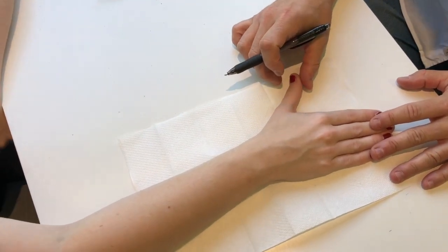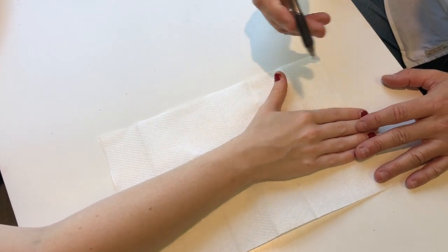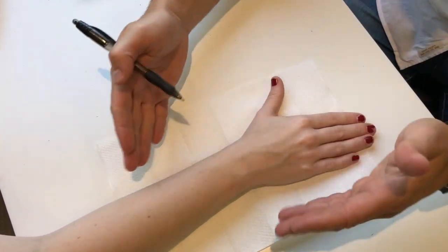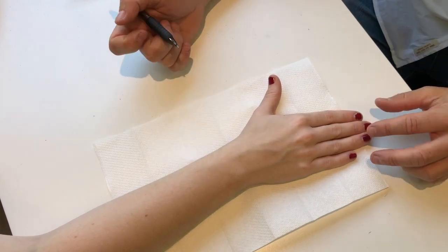So we're doing a wrist and thumb splint today. This would be a splint that you would use, so it's a volar wrist splint basically, but with a thumb component included.